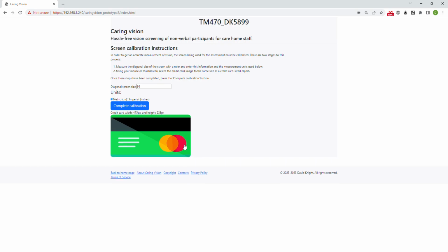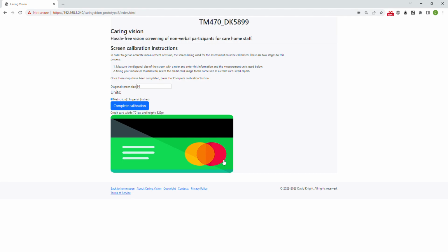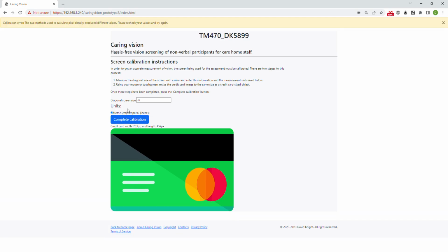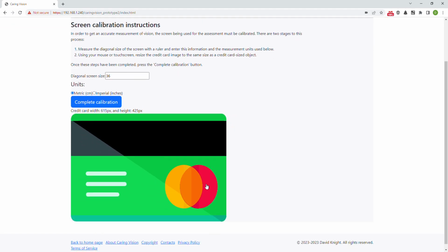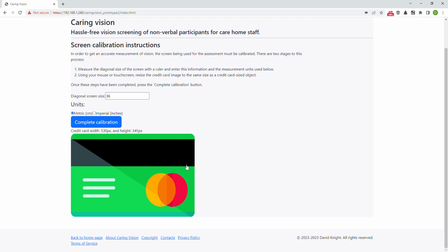So I'm going to set that now to the same size width there. There we go. That's about right. I'm going to complete that calibration. Now what it's telling me is that the two values are different, and the reason they're different in this case is because the screen is actually blown up. So I'm going to reduce the screen size now to the normal 100% level. I'm going to do that again. And now hopefully it will, yeah, that's great.